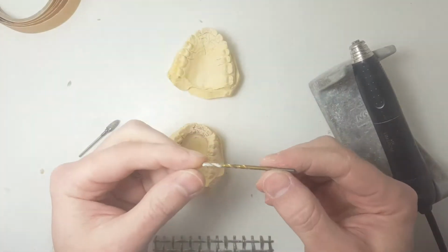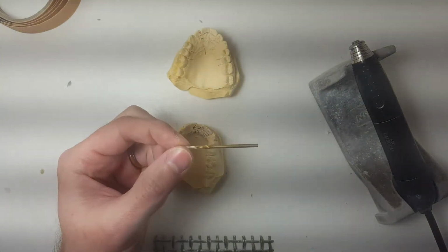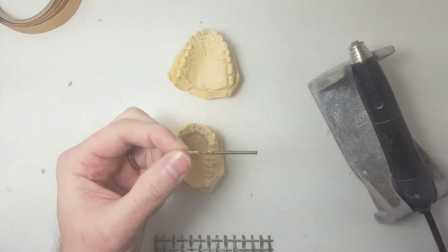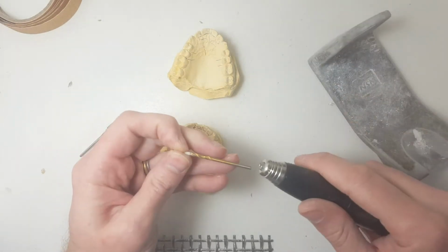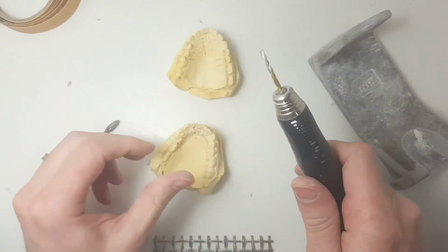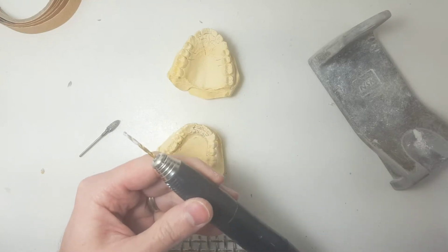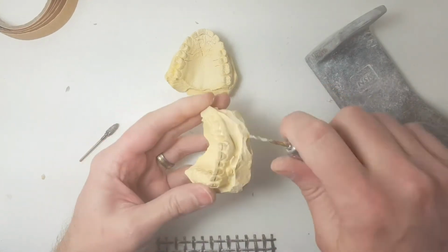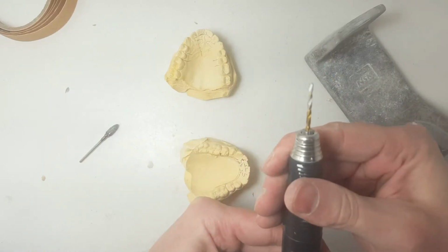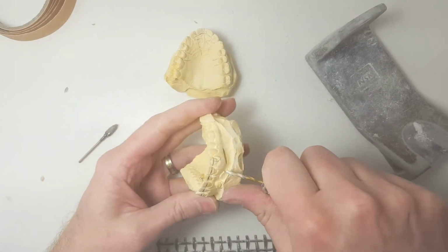And I've got this little drill bit that a friend of mine gave me, a guy I used to work for. Oh, stupid lines. Get out of here. There we go. It actually fits perfectly in my handpiece. Does a great job. If I turn on my handpiece here, it does a great job of drilling in.